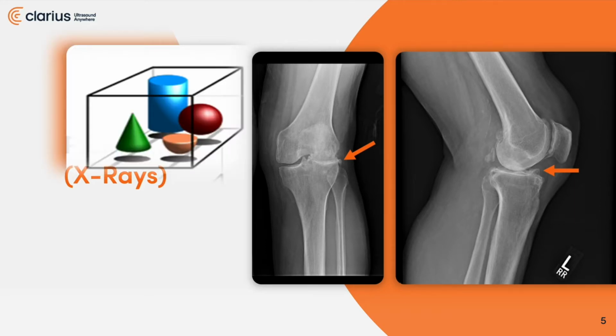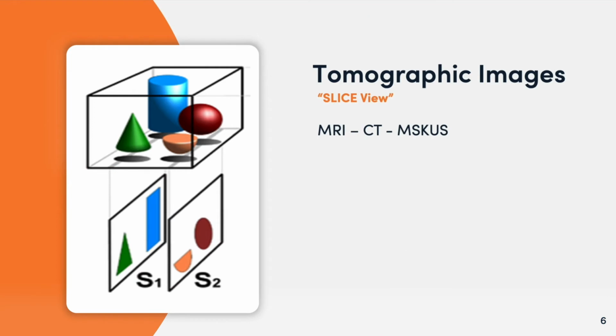That's why, when we take a look at the second imaging modality, which is the tomographic slice, things become a little bit clearer. In that same room where objects exist, in a tomographic view, such as an MRI or CT slice, we're pulling out of that room the images only associated with that particular slice. In this case, your friend behind the sofa would not be seen at all, but details on the sofa would be very clear.